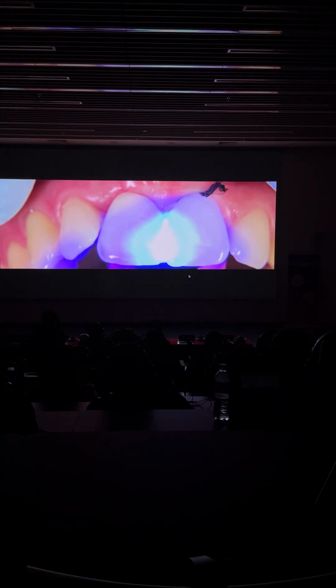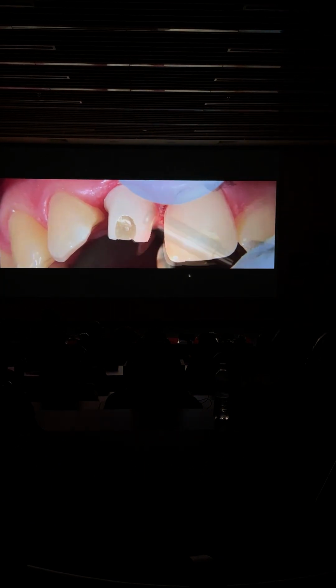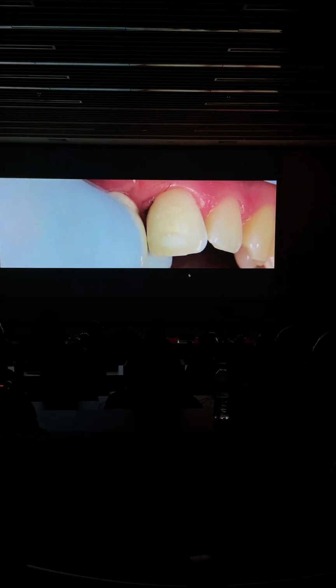Once I have the final crown the way that I like it, I modify the contour of my tooth. It's way too concave. I want to push my papilla. I want to have a contact surface from the point, and I make one contact after the other. Okay, these simple cases, I create an emergence. I polish. Use discs. Once I have done one side, then I go to the other side.